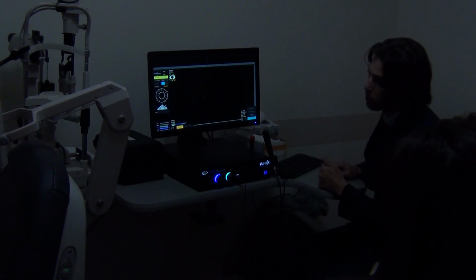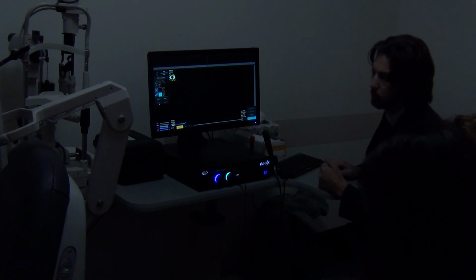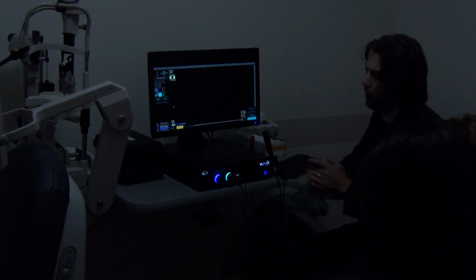So once you choose sulcus to sulcus, you can go into the tools right here, and you see this little eye tracking software, like the button. You can click on that too. Once it's highlighted in blue, the additional tool will apply once you start to do the test.